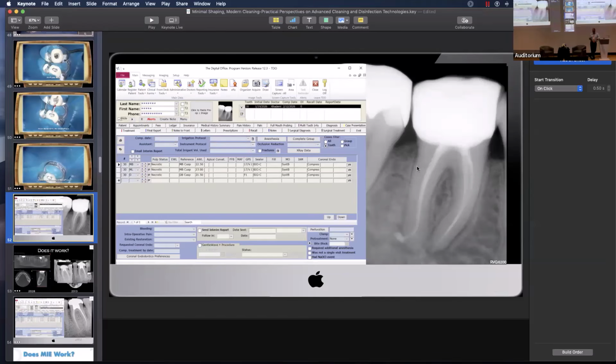So I used the endoguides, and then I was still having trouble getting the files in, and that's when I came back with the FlowLogic 1004 or 1006. I don't remember which one it was. In that video a little bit back, the second case, you could see I was actually pushing on it and brushing it against the sidewall. So in my mind, that was kind of an orifice opener.